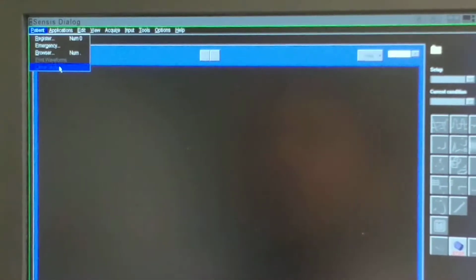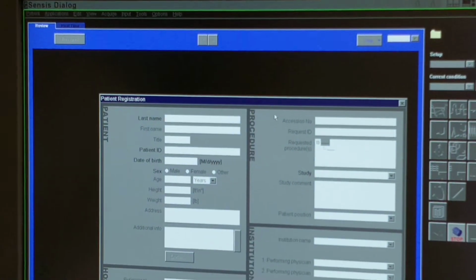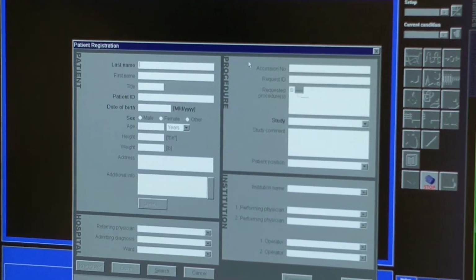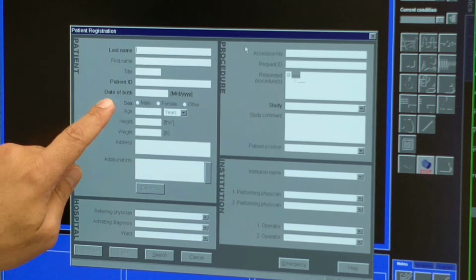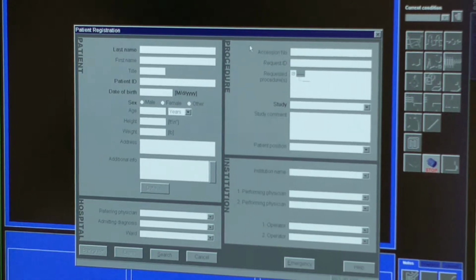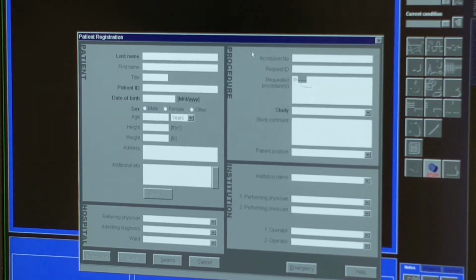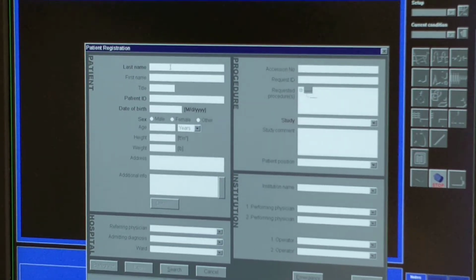So let's register a patient. I press register. This screen comes out. What do you notice in the words? There are some bold words, right? The bold words are mandatory fields. Excellent. Must, mandatory, should. All correct. Good. So the name. Last name.